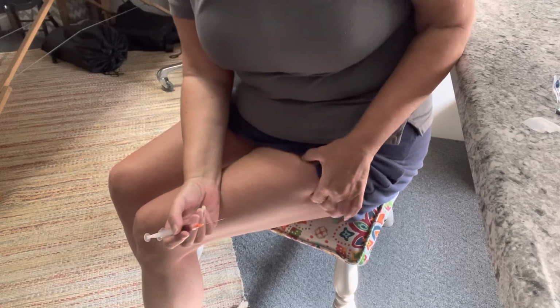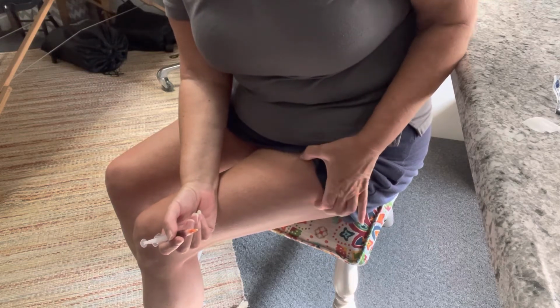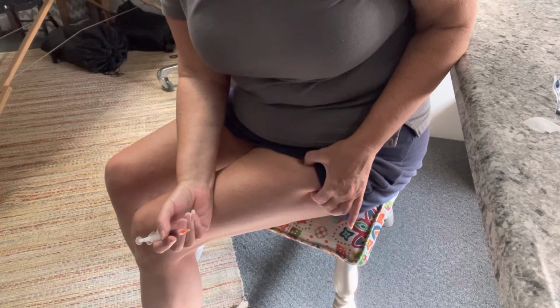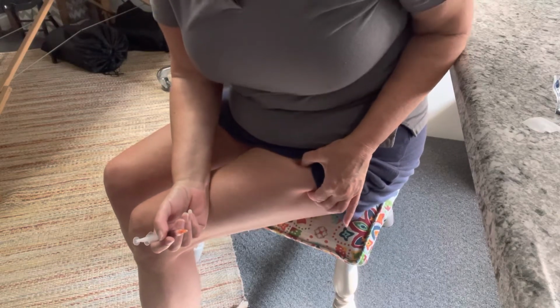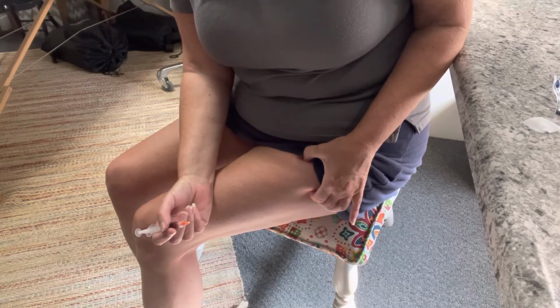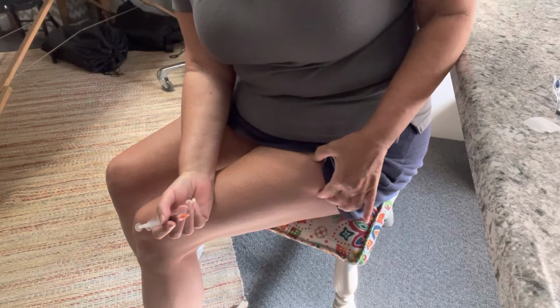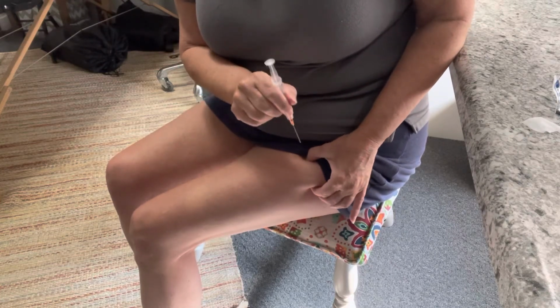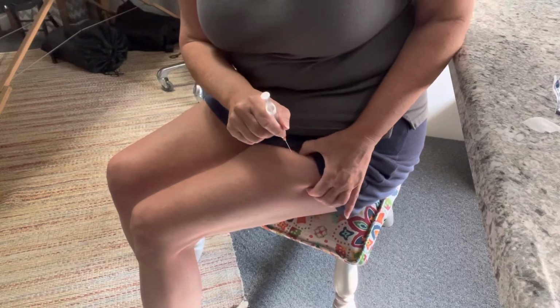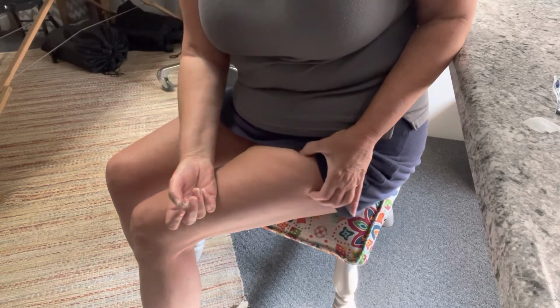So a couple of tricks I want to teach you. One is if you use your fingernails to press into the sides of your skin, you can sort of deflect the injection sting, the pain when your needle punctures the skin. Your brain is sensing all of these different impulses. I'm pressing with my thumb and my fingernails into skin nearby so that when my needle punctures the skin, there's less pain noticed. So I'm pressing and then I inject and then I remove the needle. Okay? Quick and simple. Very easy process.